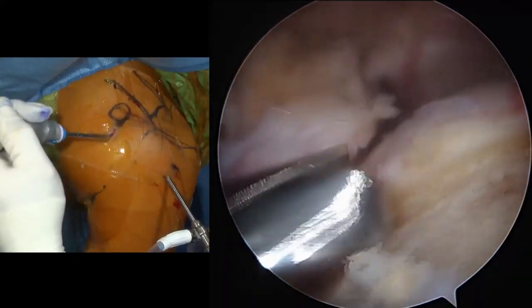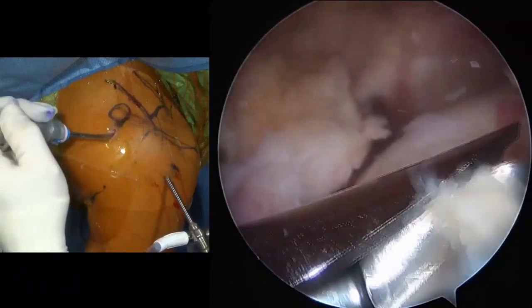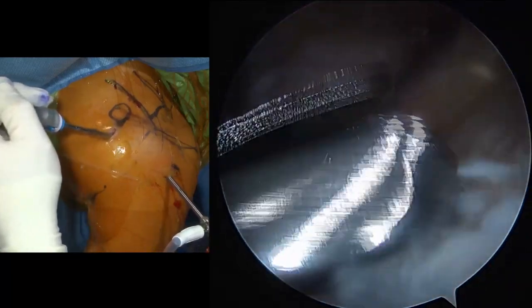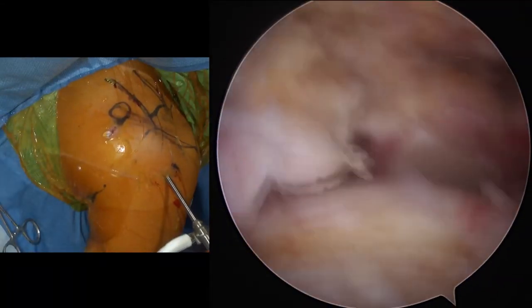But I think the most important thing is to make sure that we roughen up the bone so it gets some petechial bleeding, especially in a younger person where we think the blood supply is still going to be very good, and then maintain the quality of the strength of the bone by not going too deep so the anchors will hold very nicely for us. Let's have our shaver for a second, please.